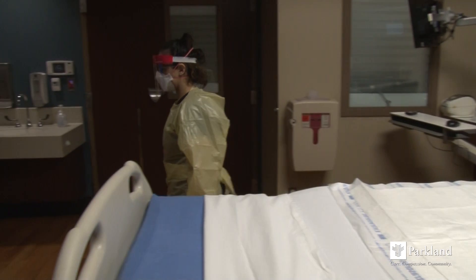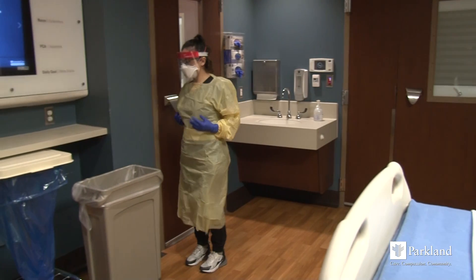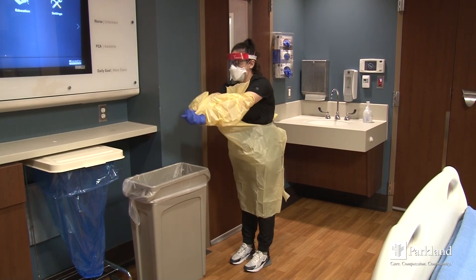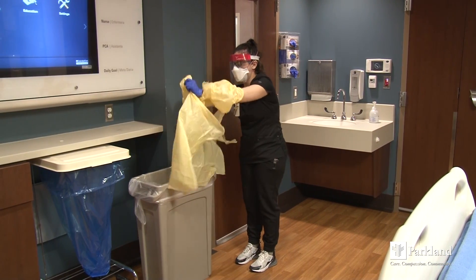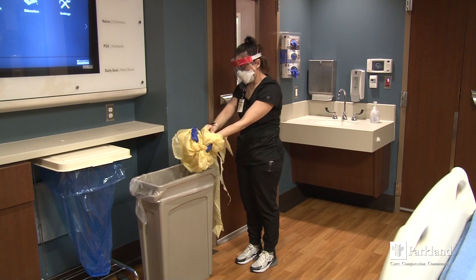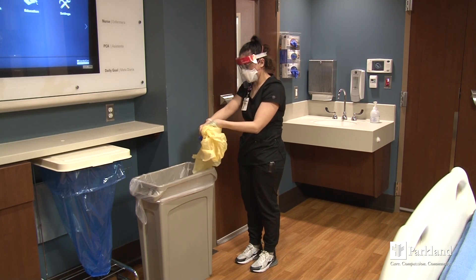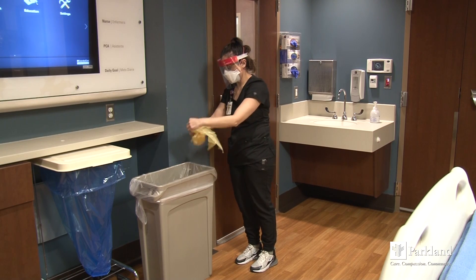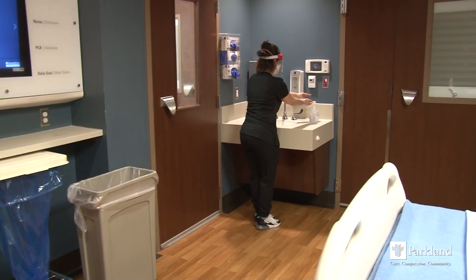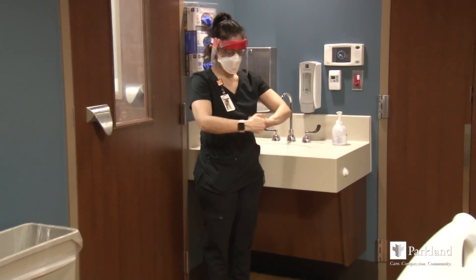The PPE removal process begins at the threshold of the patient's zone before exiting. Begin by removing your gown and gloves together. Remember the front of the gown and your gloves are contaminated. With your gloved hands, grab the front of the gown and pull away from your body so that the ties around your neck and waist break. Fold or roll the gown down away from your body. When you reach your wrists, carefully slip the gloves off your hands in conjunction with the gown sleeves. Continue to roll and condense the PPE until it is in a small bundle, dispose in the wastebasket inside the door, and perform hand hygiene.